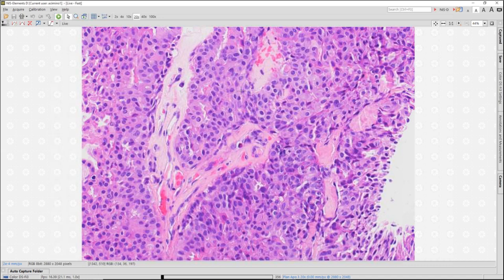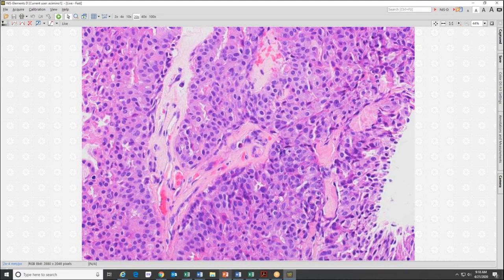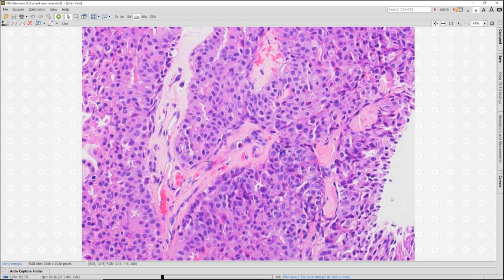And then these proliferating epithelial cells are fusing, in essence, proliferating entirely between one fibrovascular core and another, with swirly architecture, overlapping cells, variably sized nuclei, some slit-like spaces, no monotony, and no rigid polarization of spaces. This is a florid usual duct hyperplasia involving an intraductal papilloma, or you could say an intraductal papilloma with florid usual hyperplasia.